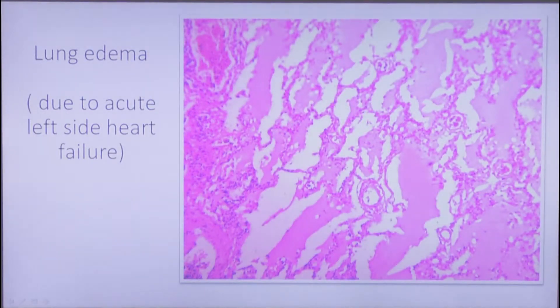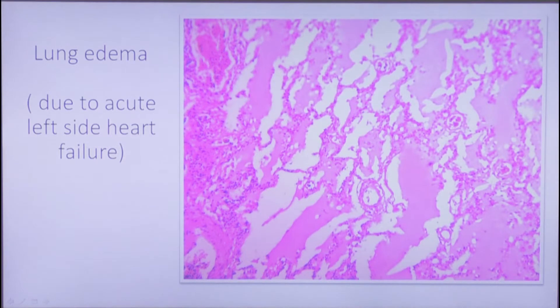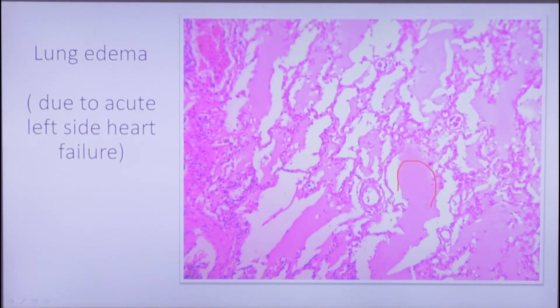This is how lung edema looks under the microscope. When the heart abruptly stops pumping blood, it leads to acute venous congestion in the lungs. The alveoli are filled with a smooth or slightly floccular pink material consisting of plasma mixed with air, which is normally present in the lung.